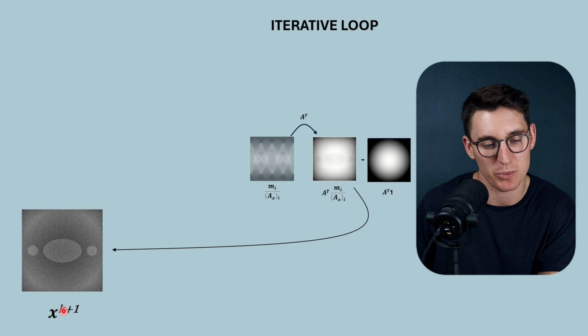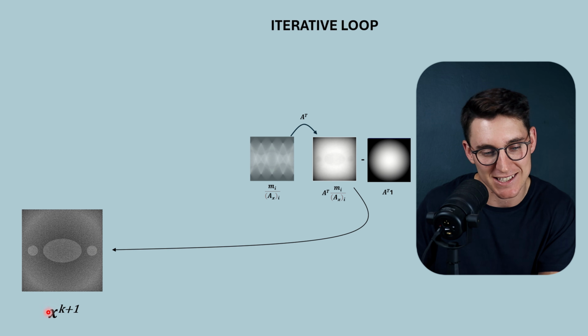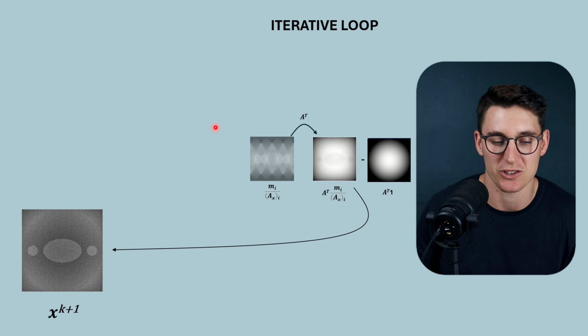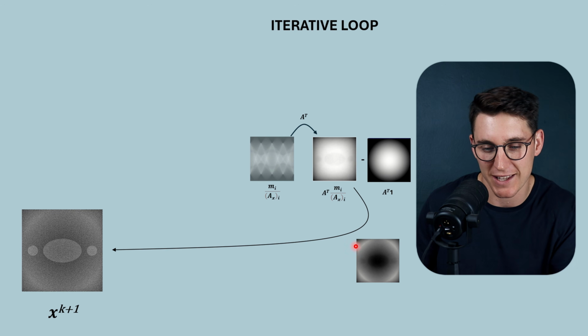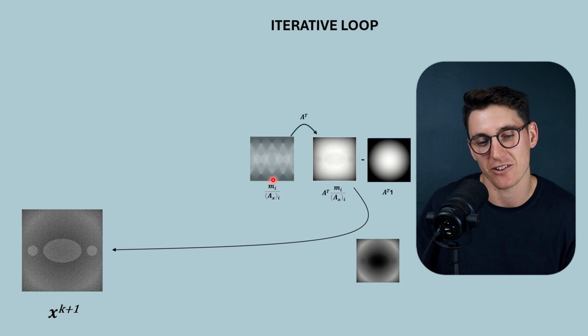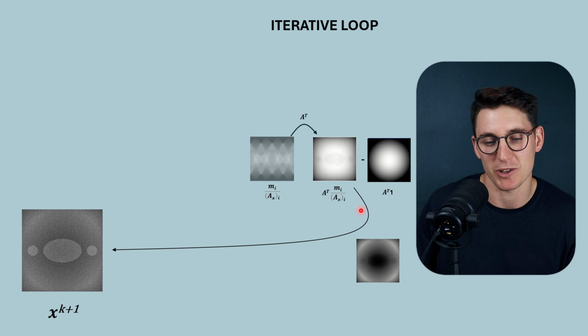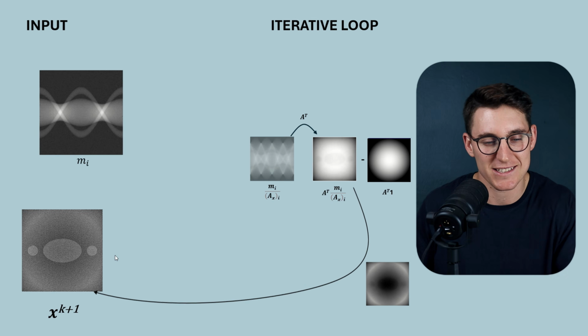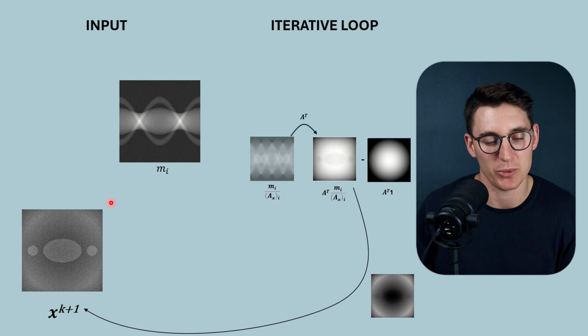x k was our first input. Now x k plus 1 is the second iterative input that we're going to place into the input part of this iterative reconstruction loop. Remember where that's come from: this gradient image that we've generated by creating a ratio between the sinograms, transposing that ratio, taking away the sensitivity image, ultimately creating our gradient image, and we're adding that to our initial image estimate. What that does then is allows us to update our input here.